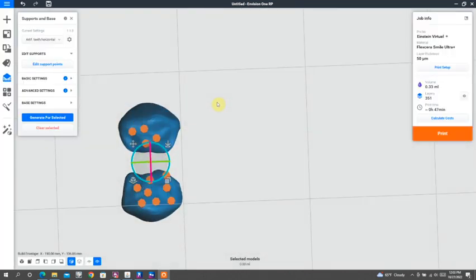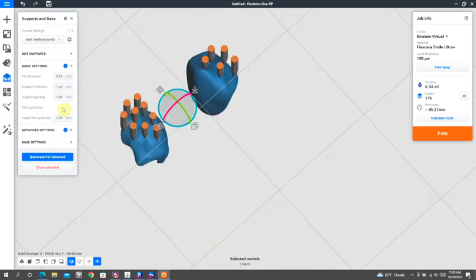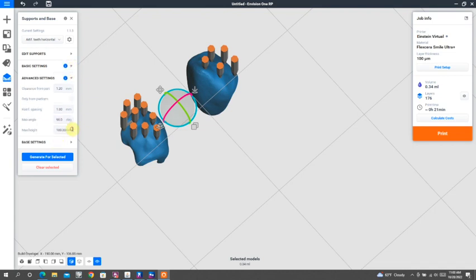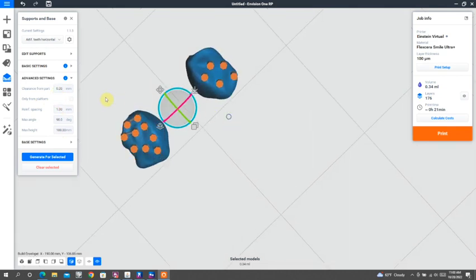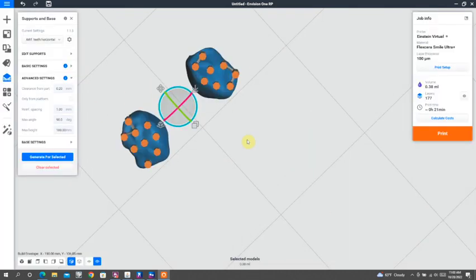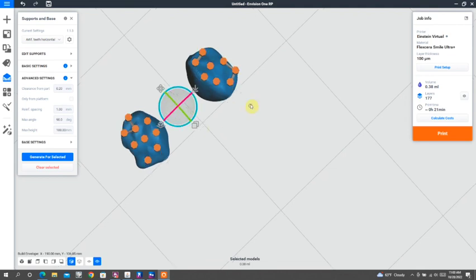The software was doing something weird where it was actually removing some of the supports that I was placing. So what I've discovered is that if you go into Advanced Settings, there is a feature called Clearance from Part. And that default is at 1.2, and you can take that all the way down to 0.1. Here I took it to 0.2 and then was able to add that additional density of contact points back to my build.